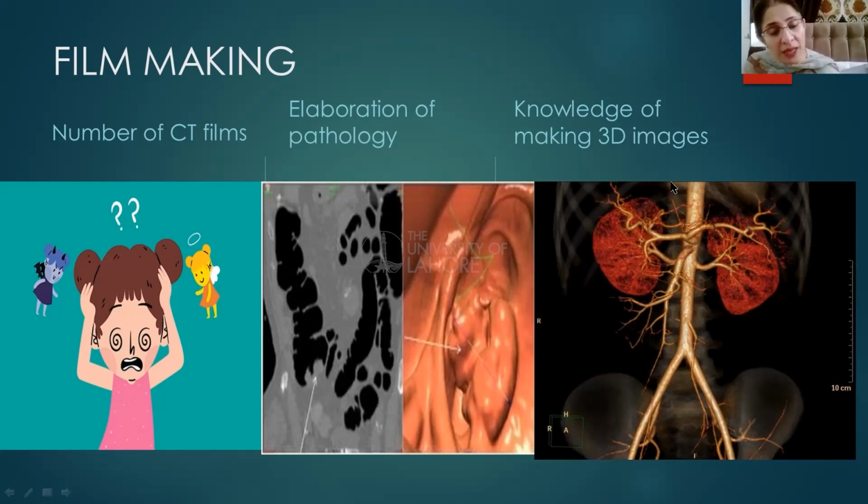This needs to be resolved. A few steps that can be taken in this direction: if you can identify the pathology, you can elaborate it in the form of these arrows. You can point out these arrows indicating the pathology. You can label the pathology as well. This is an interesting way, because it will make the clinician at ease, and he will understand the pathology better.